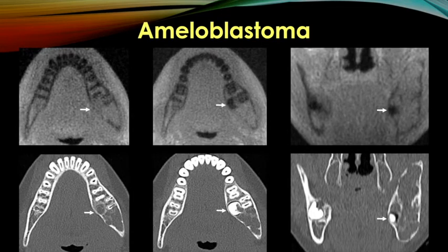Dental MRI is actually very common in some countries, for example, Europe, to examine the health of the teeth and also distinguish amalgam and other synthetics from bone. This here is a case of an ameloblastoma, which is being followed in the short term, and certainly there's a bit of resolution limitation, but we can still appreciate the overall bulk of the mandibular lesion, some of the multilocular bubbly septations, and this unerupted molar with some erosions. Also with MRI, you can run other soft tissue sequences to better evaluate the nature of the tumor.